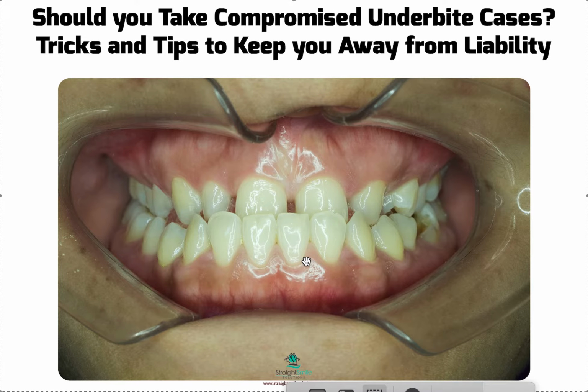Then, easiest way, honestly, to play with it for me is, I have a pretty good idea when I look at a case based on what I've done and my eyeballs, but I always like to scan it and put it in Invisalign. You can always do these cases in Invisalign if they're doable, and they've got great software. It's a great way to mock it up. Yes, maybe you want to do braces, but it's a great way to simulate the movements, and as far as I'm concerned, everything can be done in Invisalign. You just need to know how to do it. So that's what I do. I throw it in Invisalign and I play around with it.